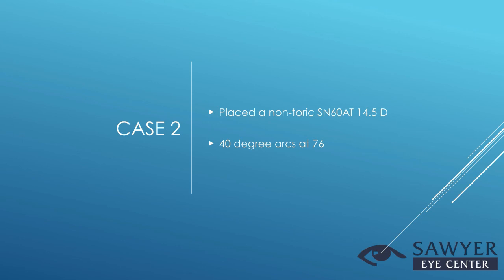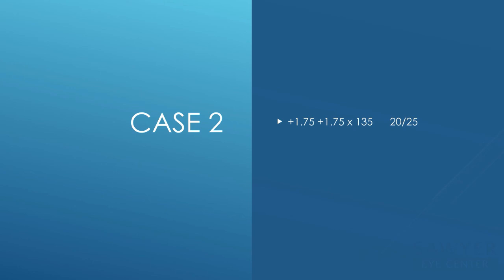Unfortunately, he still ended up with a pretty significant glasses prescription. Now, as you can tell, it's still bad on his astigmatism, but also just plain missed on the spherical correction, and this is the biggest problem. But look at his axis, 135. If I had treated 5, nearly 6 diopters of astigmatism at 76, we would be even further all over the map with his astigmatic correction.